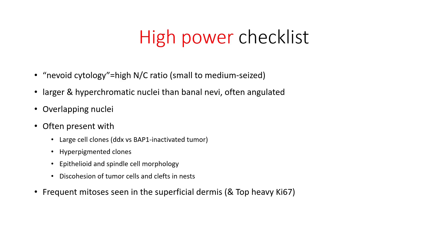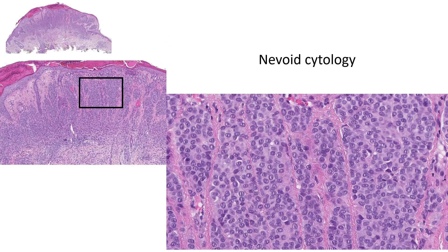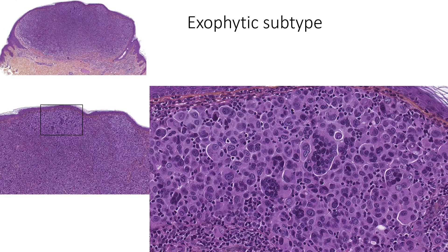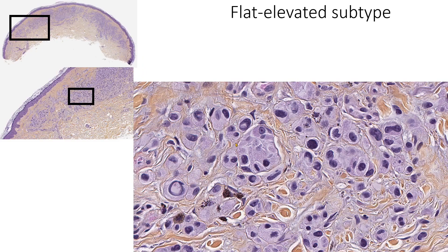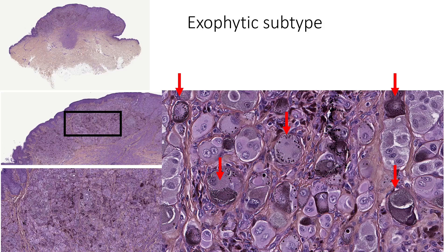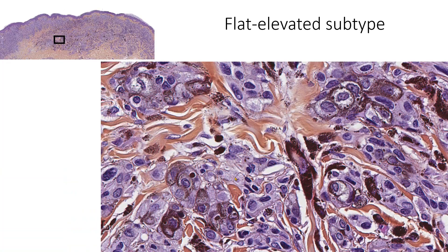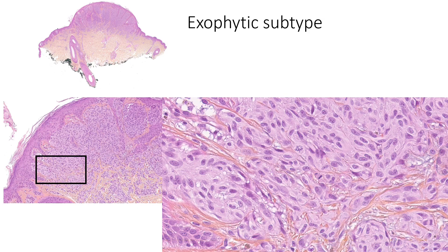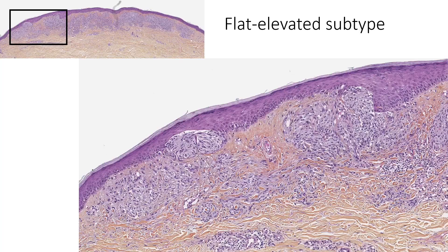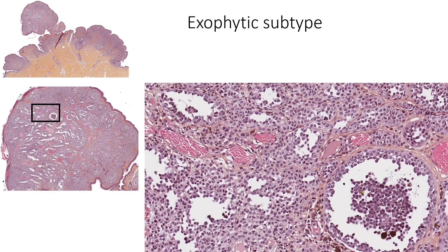Moving to the high power checklist, the first finding is the nevoid cytology — cells have round or oval small nuclei. In some instances you can have multinucleations or more important atypia. Some cases show plasmacytoid cytology, while other cases can be more spindle-shaped. In some cases there can be discohesion and pseudovascular cavitation.